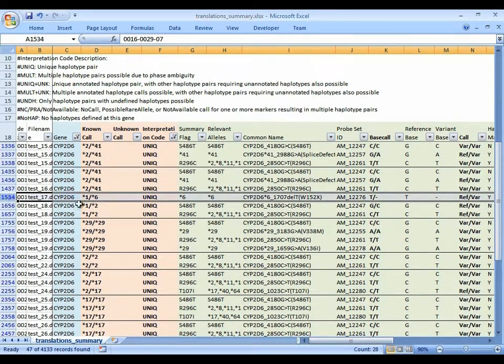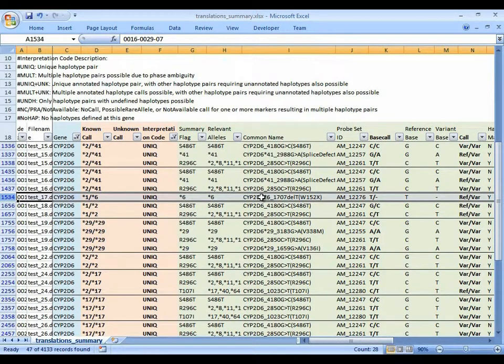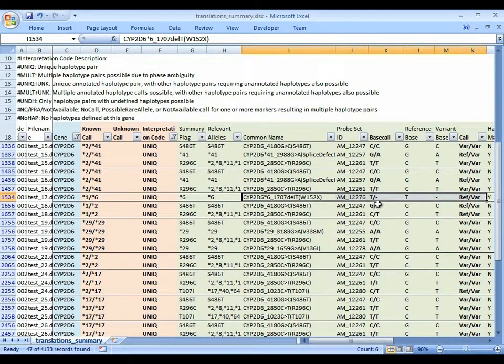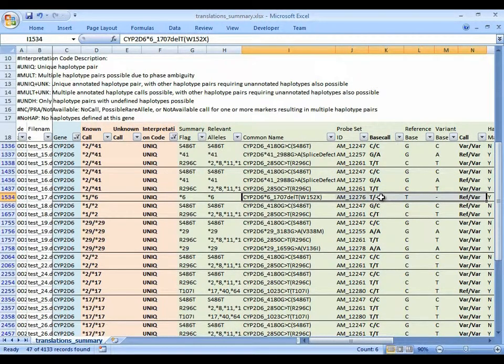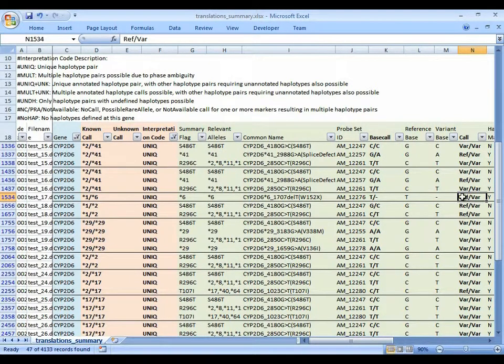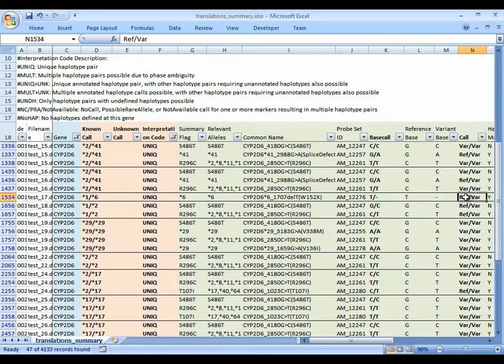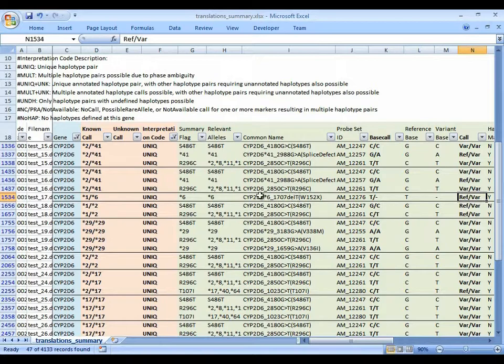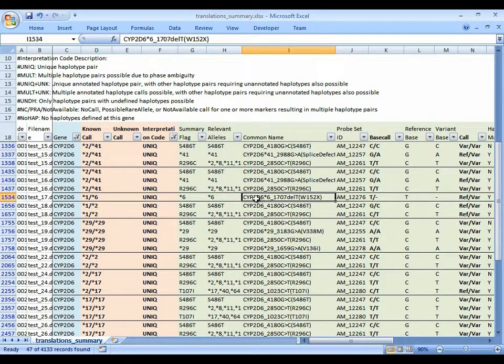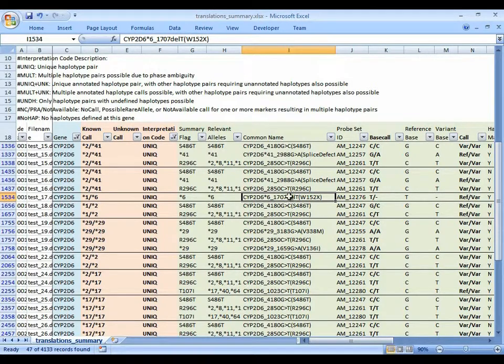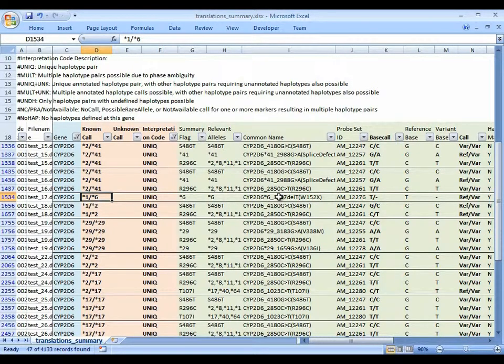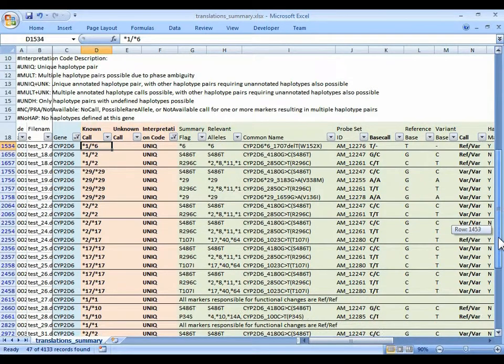Let's look at another unique call. Star 1, star 6. Here, one marker is reported. It's reporting a heterozygous deletion of a T. So it's given a reference or variant call. It's the only marker among the CYP2D6 markers on DMET PLUS that is reporting a variant call. This marker is actually considered the defining allele for the star 6 haplotype. And since we're heterozygous for it, we're giving it a star 1, star 6 call.